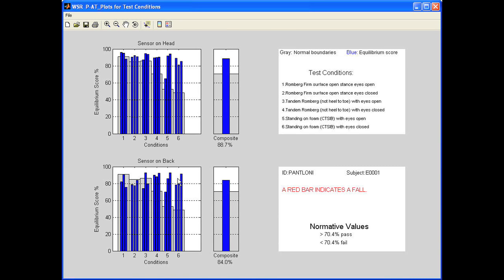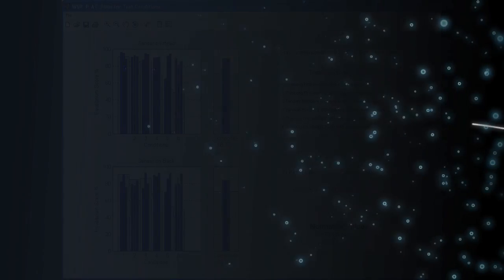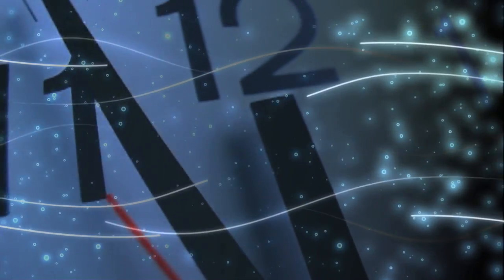Test results are automatically provided in an easy-to-read bar graph with composite percentage scores. MotionTrack takes about 10 minutes to complete and requires no special room setup. The test is made up of six 20-second conditions.